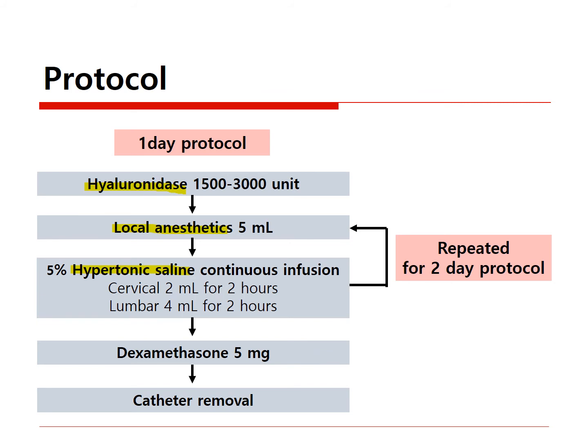There are 1-day and 2-day protocols in our hospital. The 2-day protocol is used for the patient with severe pain. The difference between the two protocols is the repetitive use of local anesthetics and hypertonic saline in the 2-day protocol.